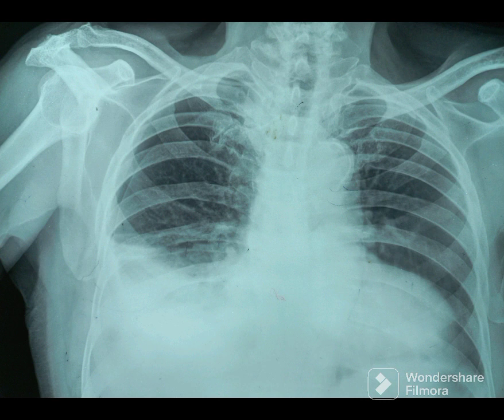So the person has a right pneumothorax. Coming down in the right hemithorax, you may note a straight line at the base of the right lung, indicating an air-fluid interface. Above you have air and below there is fluid, and that straight line indicates the air-fluid interface. So this X-ray shows right hydropneumothorax.